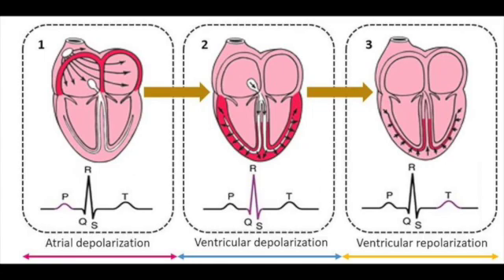And then finally, when you have your T wave, we have ventricular repolarization. So it's traveling again, in the same sort of direction, and I think you can see that as it repolarizes, it creates the T wave. Now, if you could, Michael, pull up that image of where the electrodes are placed, because that'll actually help with the visual part.